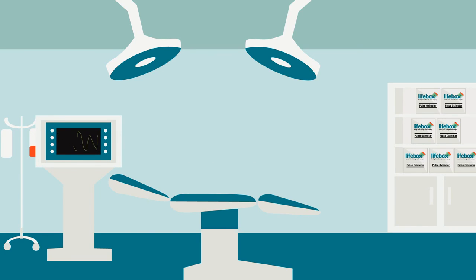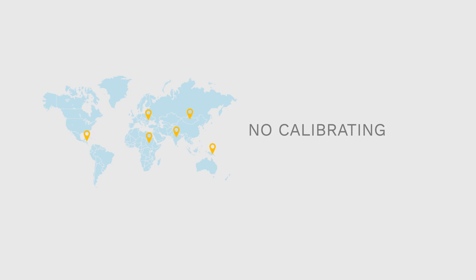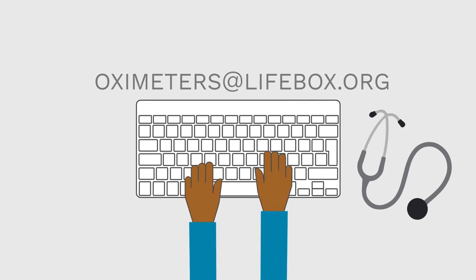Another important point is around maintenance and repair. The Lifebox oximeter was specially designed for challenging environments. It doesn't need calibration, it's easy to clean, and it's robust. But if you have a problem with your oximeter, it's vital that you let somebody know. Do not let your oximeter sit in a cupboard where it can't help you or your patients.